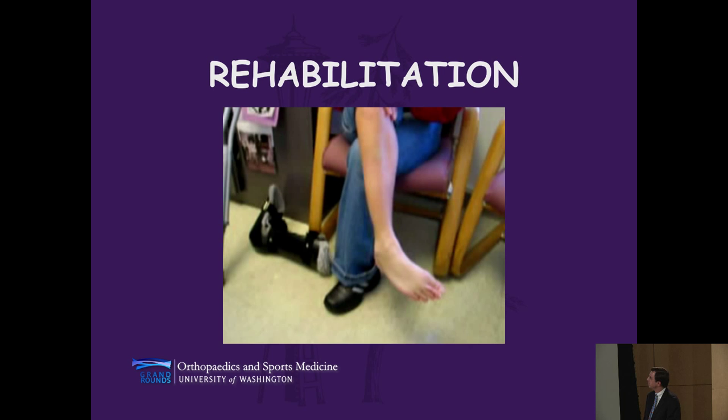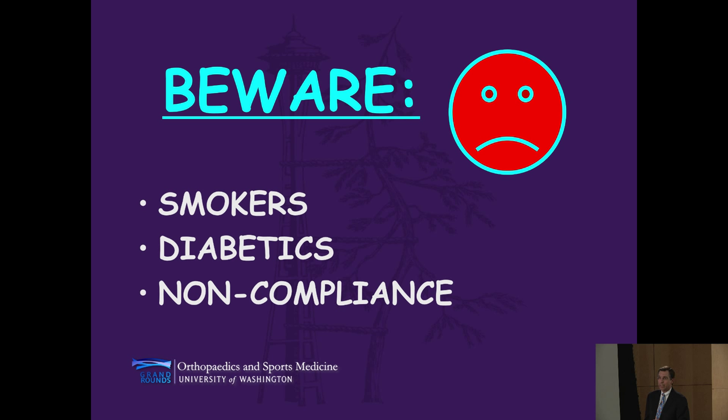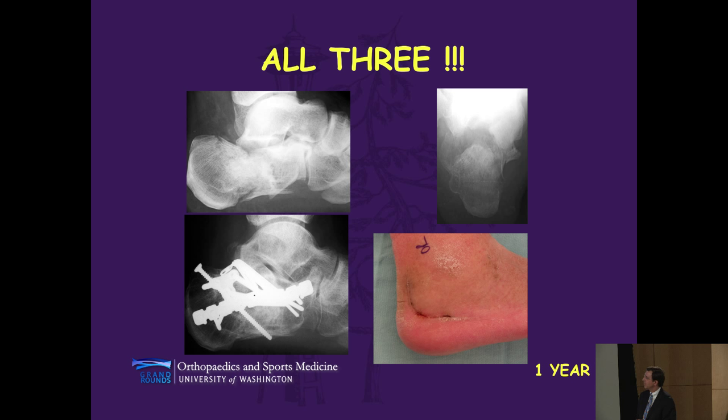The bad, concerning problems that we have are the smoker, the diabetic, and the non-compliant patients. We identified that in our study, and those patients still will come to you, and the question is how you're going to manage them. This is just an example of all three of those, and you can imagine if we left this alone, it would be a daunting reconstructive process. I elected to try to manage it, but was unable to manage this without some intermittent wound drainage here, which necessitated hardware removal, but we were able to maintain the position of his foot, and that's an easier problem to deal with than trying to manage this conservatively and then a later procedure.